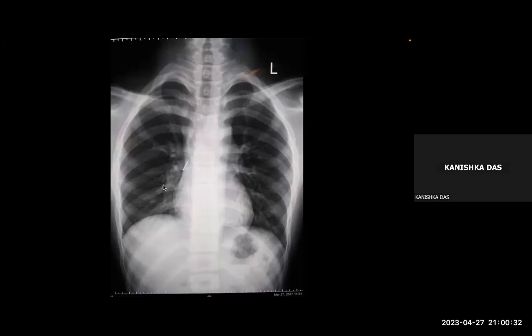So if there's a foreign body here and there's a loss of volume here, what does it tell you? You must conclude with that sentence so that they will know that you know the differences between the types of foreign bodies. Occlusion of the lower. Normally, in a foreign body aspiration that is acute, what do you see? Hyperinflation or something else? Hyperinflation is seen. But if it is blocking completely, then loss of volume will be seen. It's more than that, it is a chronicity. If this is a little chronic and it gets blocked, then the air gets resorbed entirely without any air coming in, and that's why you get this sort of a picture. So this is obviously a chronic foreign body. So how are you going to be careful when you do this retrieval?